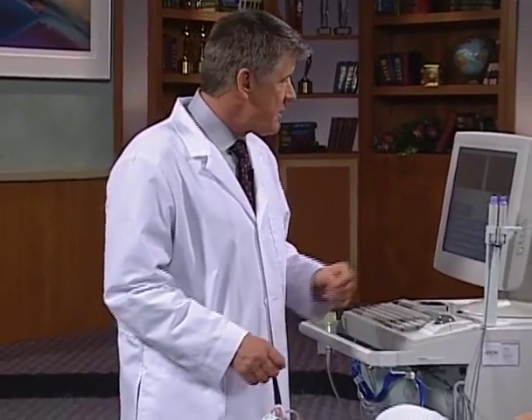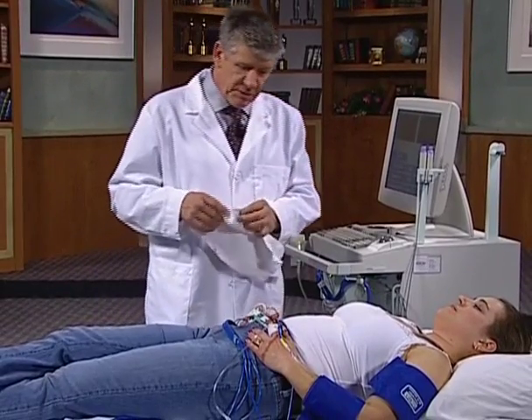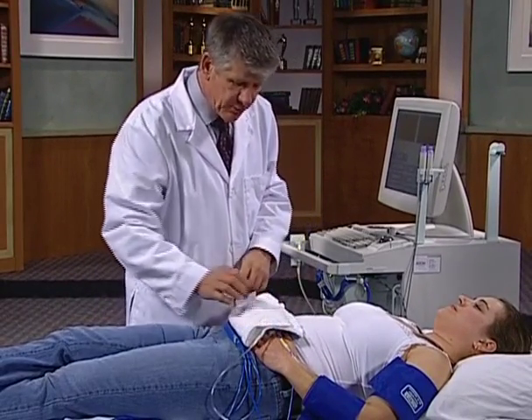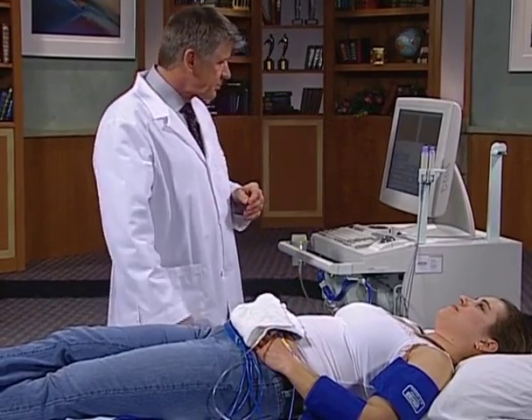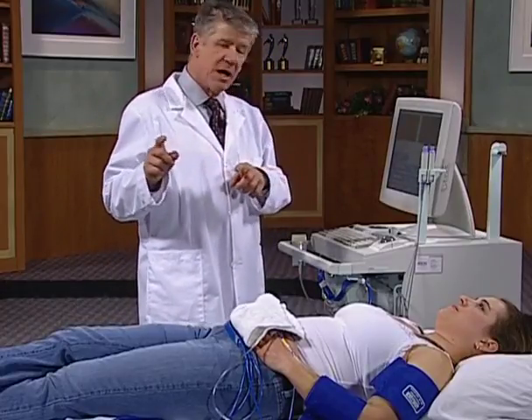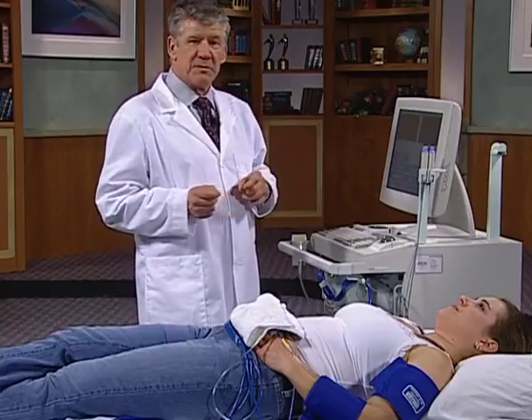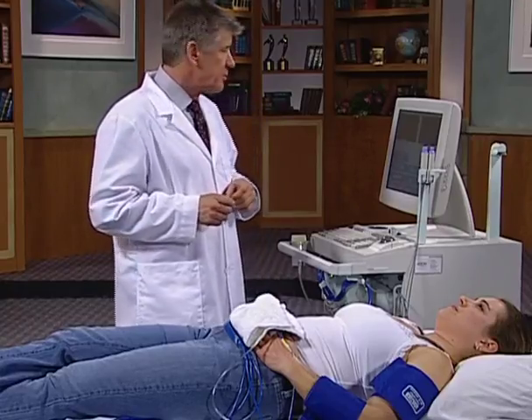Going to proceed with digital pressures. So I've applied the PPG clips to the index fingers, the right and the left side, and we're acquiring waveforms now. I'm going to cover these up with a cloth again. We've got our digit cuffs on. We'll inflate the cuffs until the PPG stops, bleed back down. When the pulses return, that first pulse that comes in, that's the digital pressure, the systolic pressure.